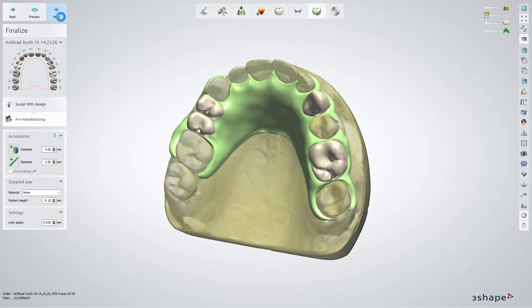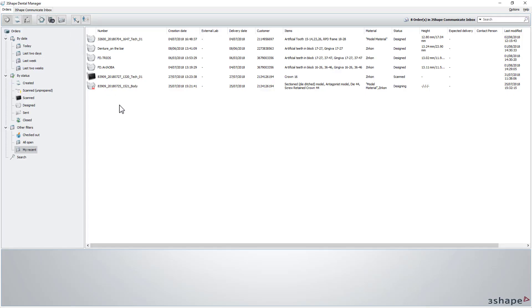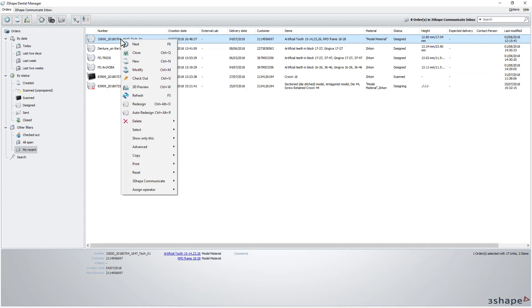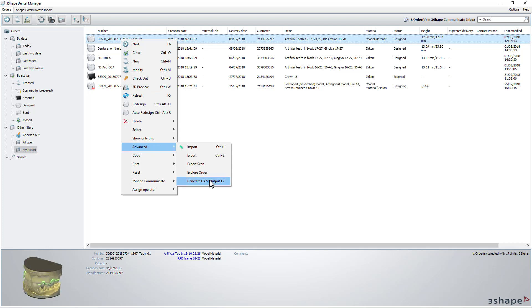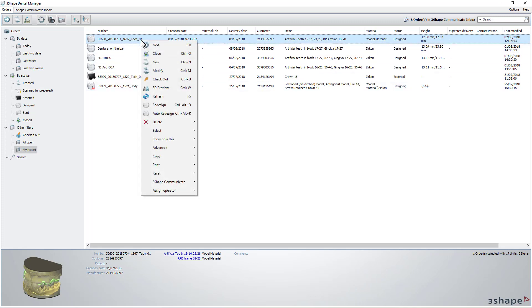Now you can save the design and send it for manufacturing. Click Close to save the output result. To check the output files, first you need to generate the CAM output. Do it by right-clicking on the case and choosing this option from the Advanced menu. Now click the case once more, and from the Advanced menu, choose Explore CAM.